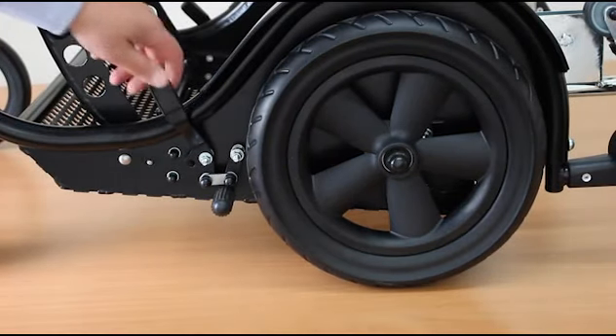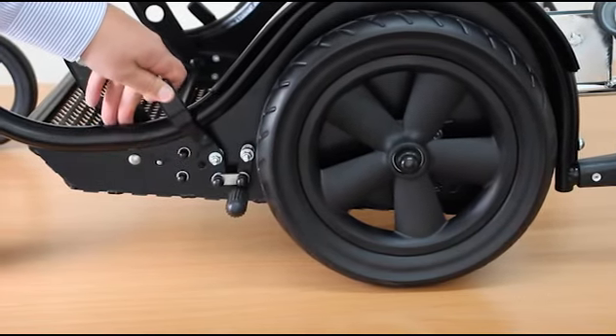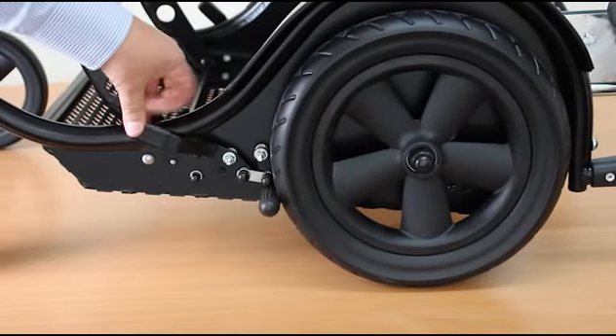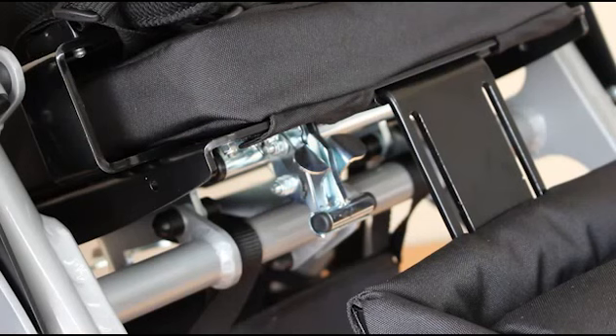The brake is independent on each side — applied by pushing the lever down and released by lifting it back up. It's important to locate the brake on both rear wheels.